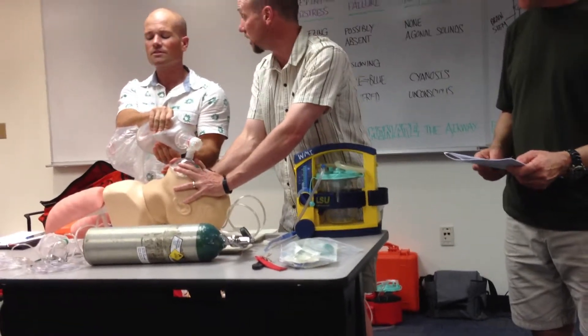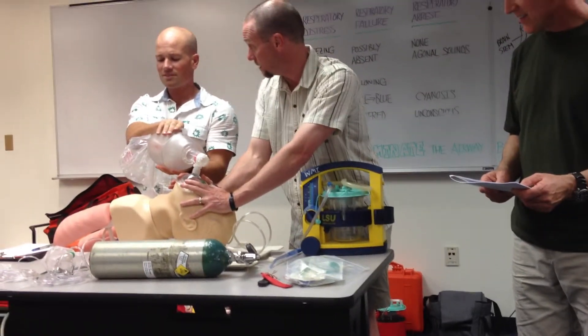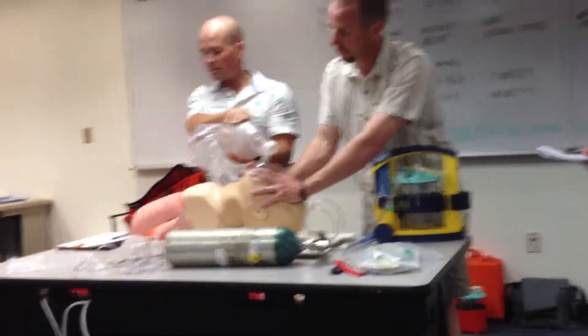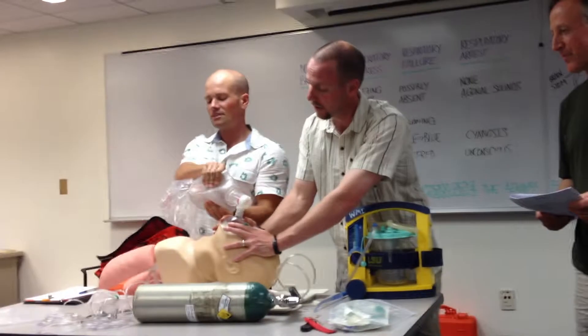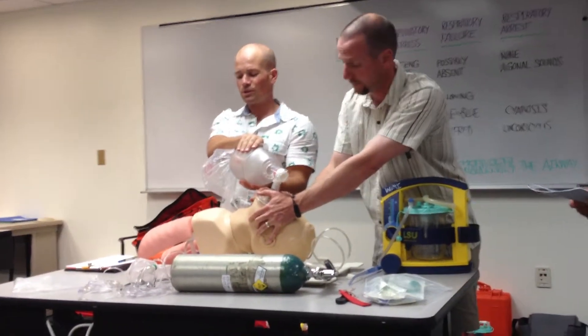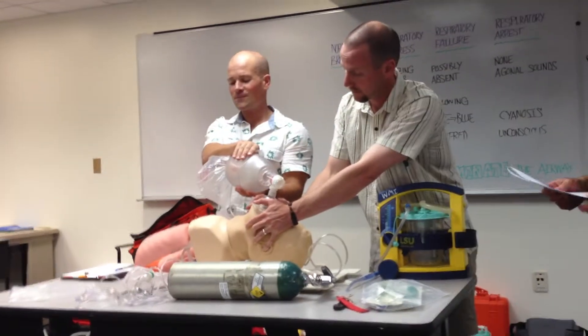A little more smoothly — I know you just arrived. We've done something like this before. So let's go ahead and show the proper technique.